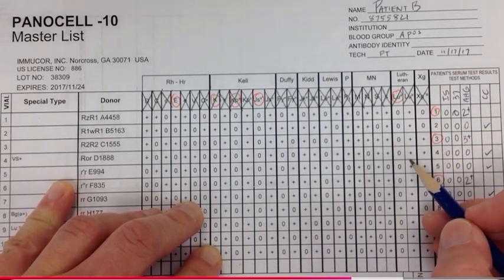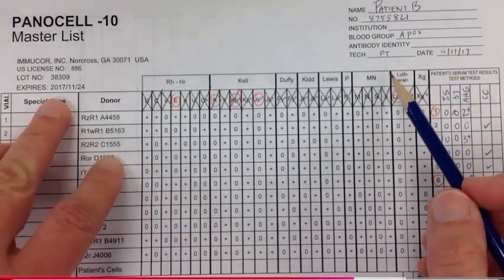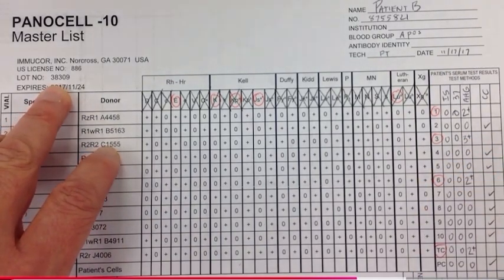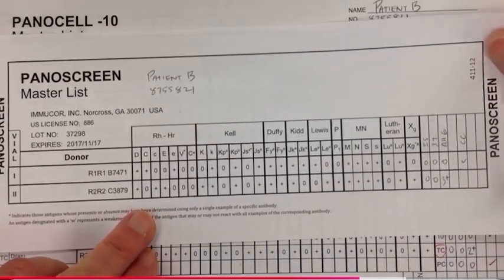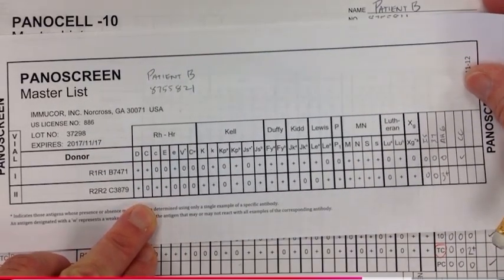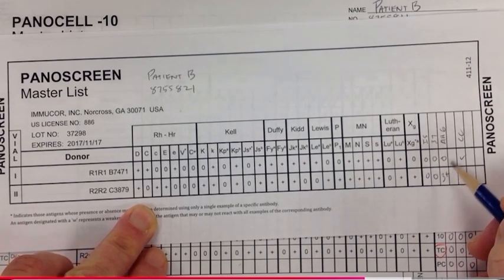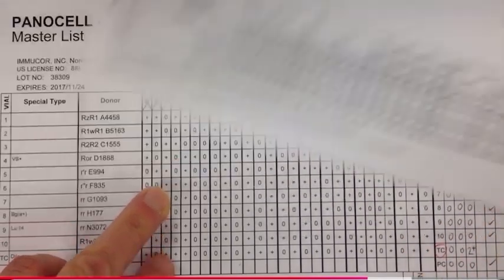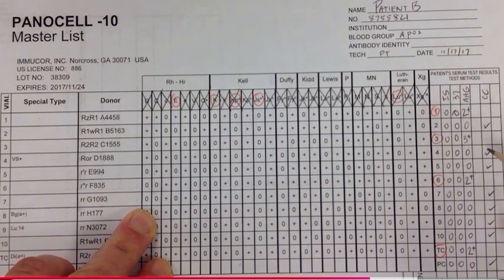So one thing that you could do is you could get another cell from another panel from a different lot number, and you're going to try to find one that is going to allow you to have two rule outs. Let's see, we could take a look at the antibody screen here, and okay, this doesn't really help because it's negative for Lutheran A in both of these. We're going to need one that's positive, but that comes up with negative reactions.